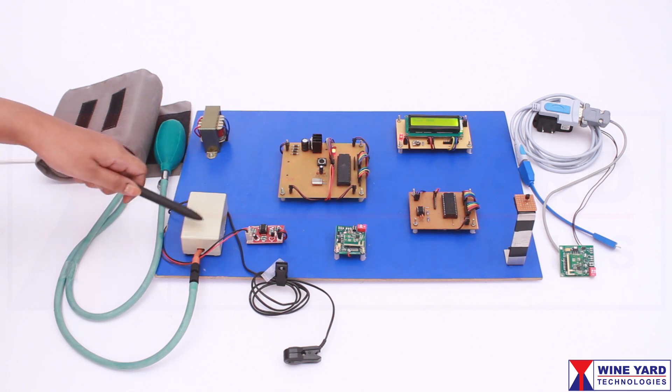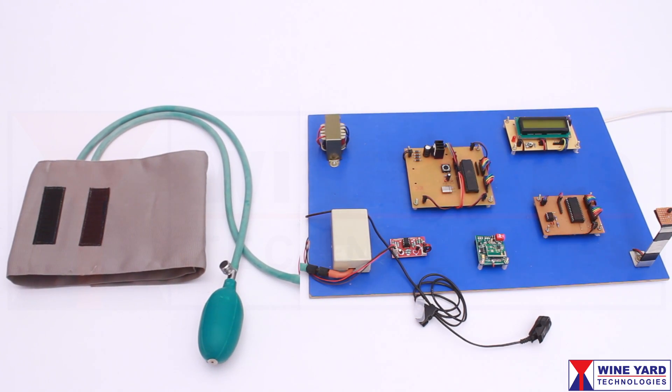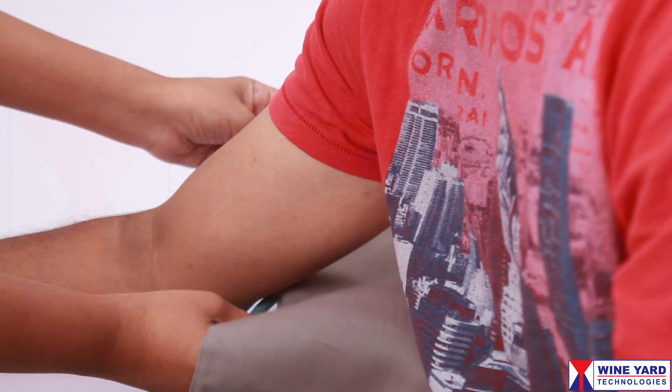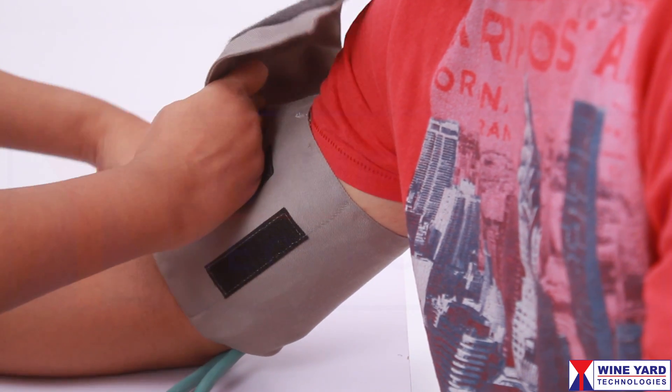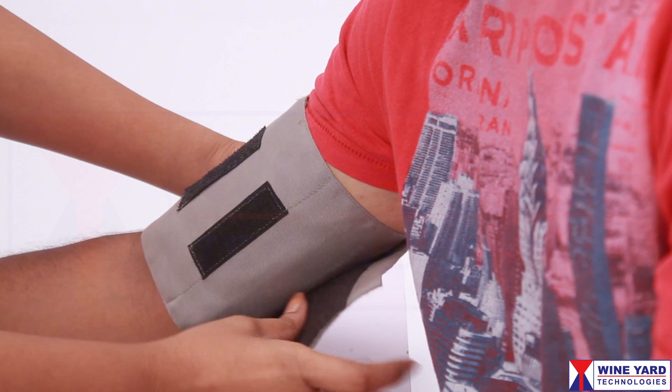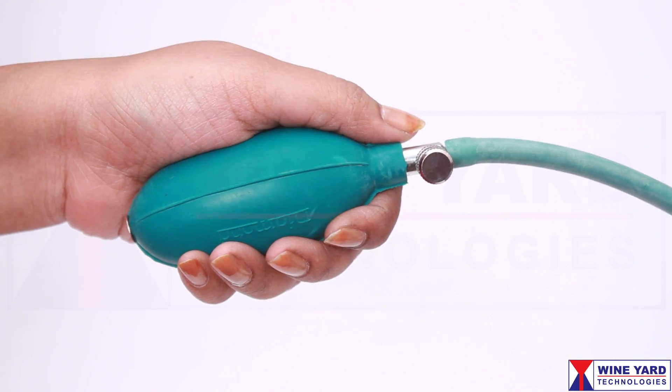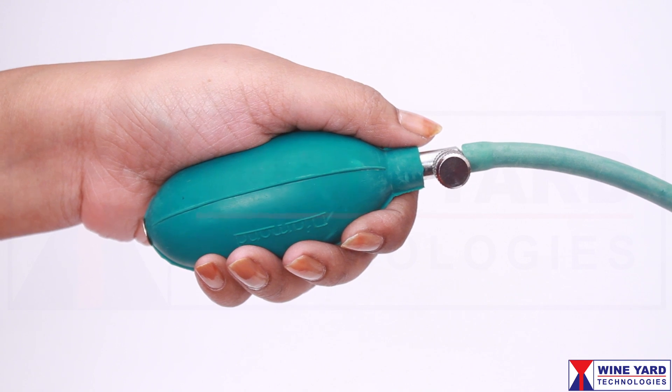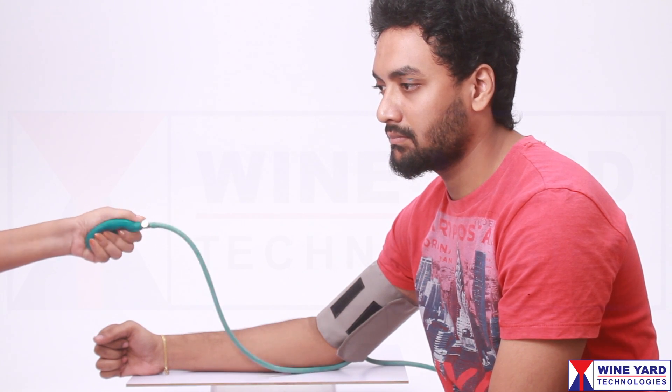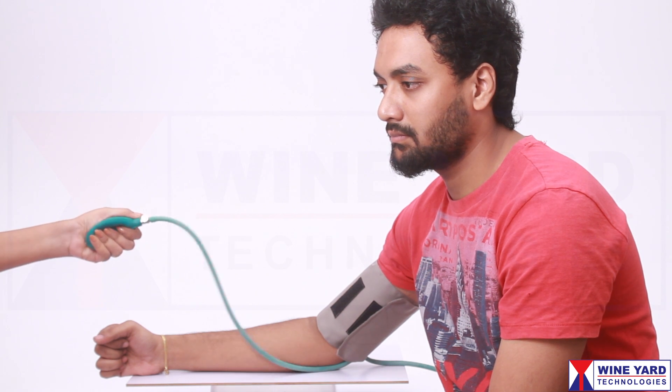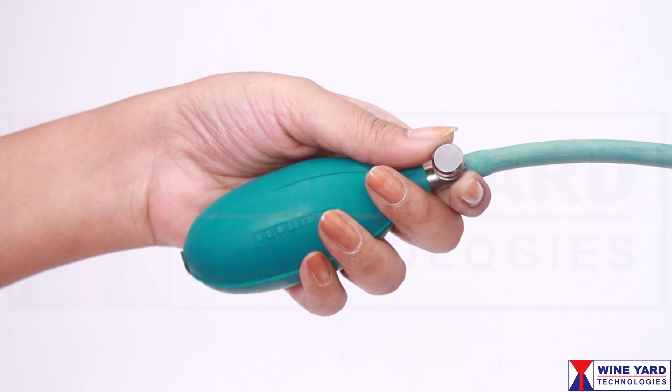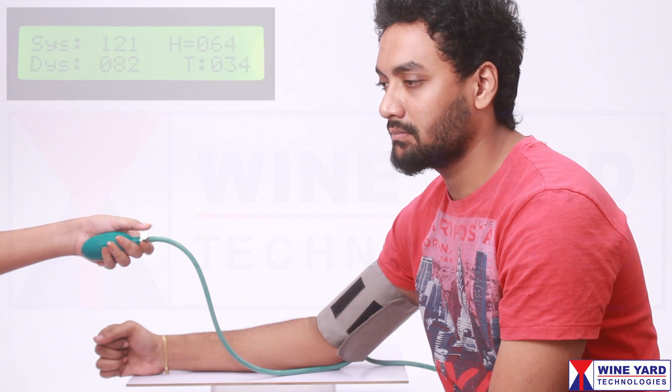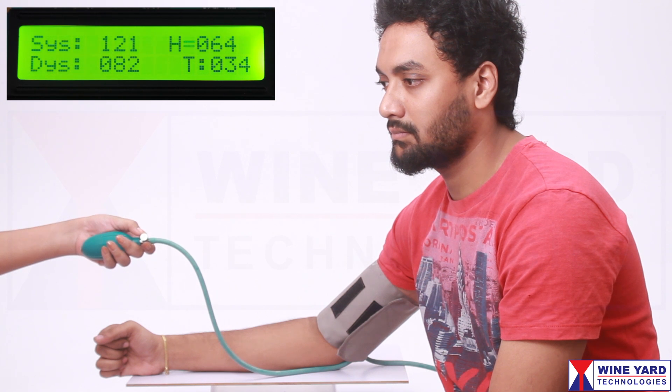This is the blood pressure module. We are measuring with this air belt on the user. Apply air pressure by pressing this air pump. Slowly release the air after some time. Now the system measures the blood pressure and displays the systolic and diastolic blood pressure on the LCD.